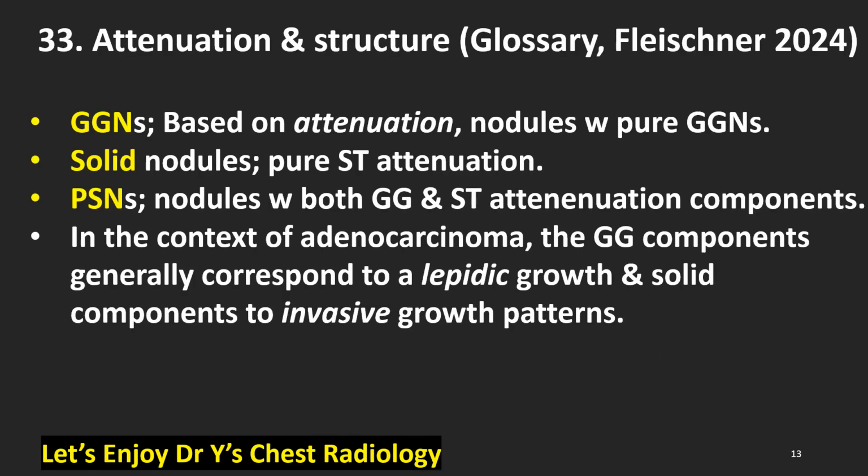Attenuation and structure of the nodules. Ground glass nodules, based on attenuation: nodules with pure ground glass attenuation are ground glass nodules. Solid nodules: pure soft tissue attenuation nodules. Part solid nodules, PSN: nodules with both ground glass and soft tissue attenuation components. In the context of adenocarcinoma, the ground glass components generally correspond to lepidic growth and solid components to invasive growth patterns.